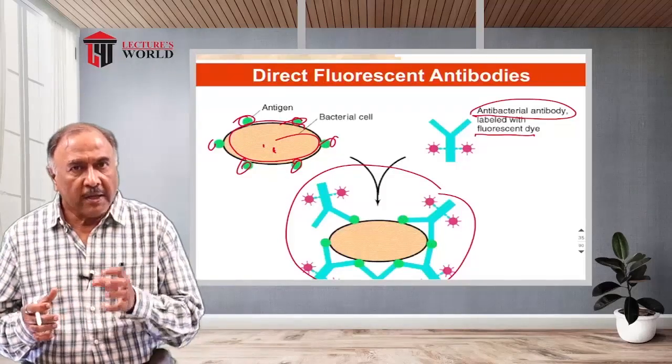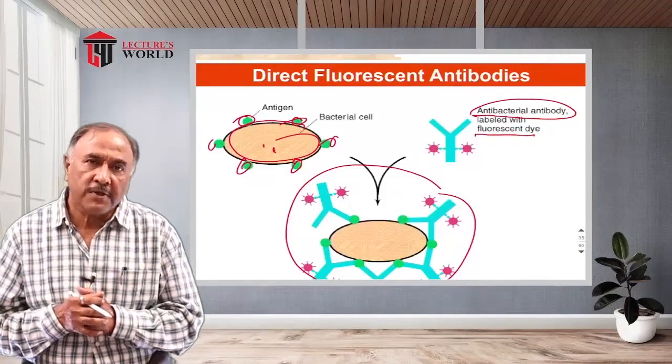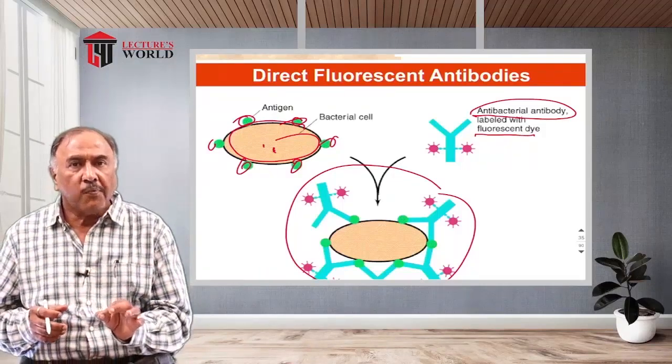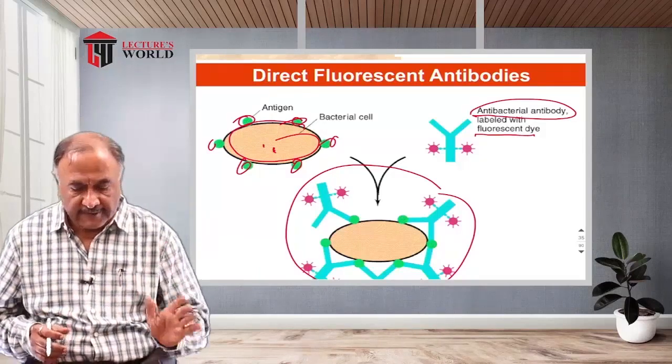So, an antibody against a specific organism is being used here. What makes them fluorescent is that the antibodies are tagged, tied with some fluorescent dyes.